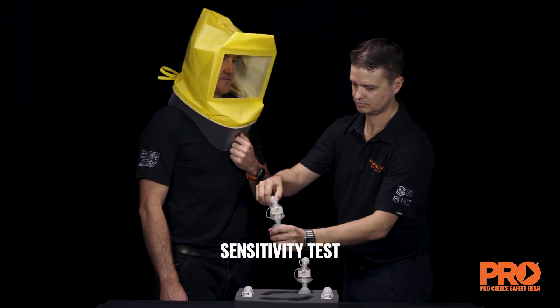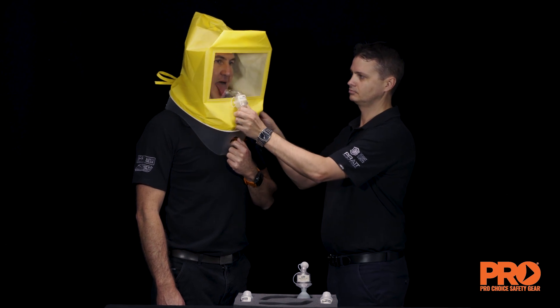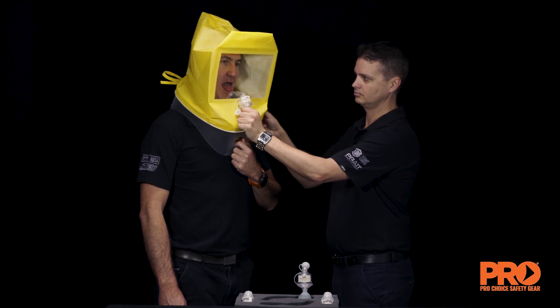Sensitivity test. This pretest is completed to ensure that the wearer can detect a bitter taste of the solution at very low levels. The sensitivity test solution is a very dilute version of the fit test solution.